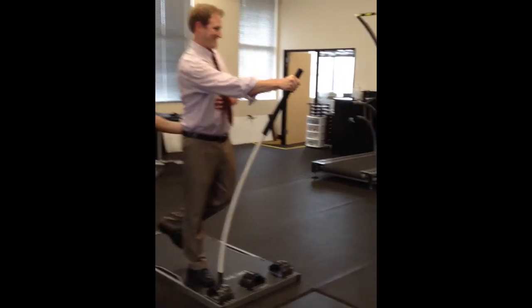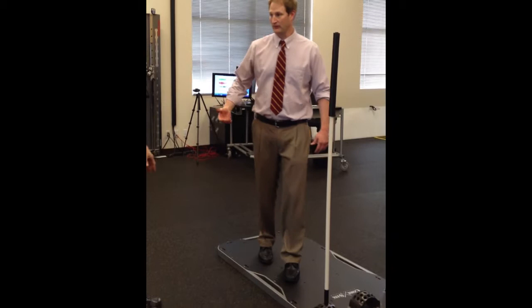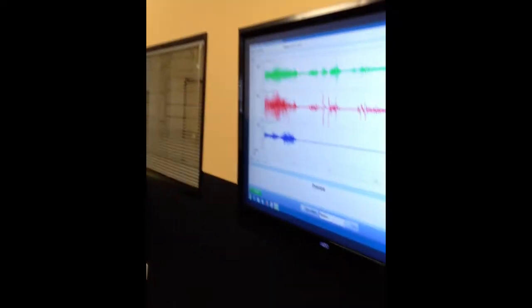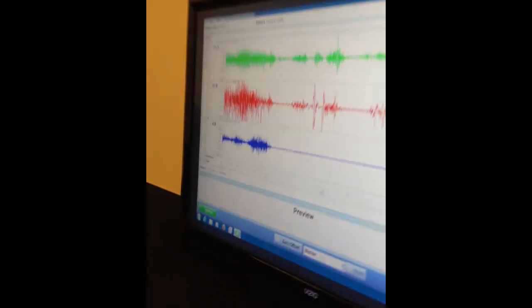There you go. Oh man, I lost it — it's just fatigue. It's wiped out. But look at that first stage activation, man. Look at that glute med and glute max — it's up there. Look at the minimal quad. Minimal quad. Yeah, it's great.